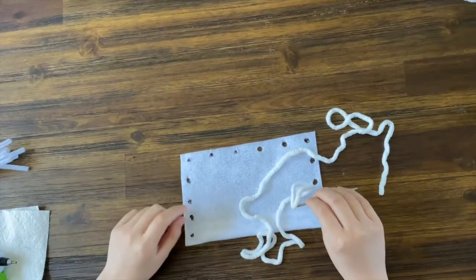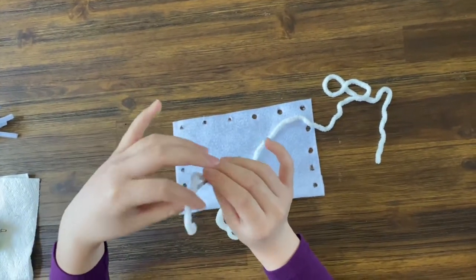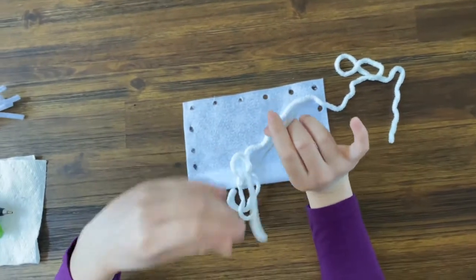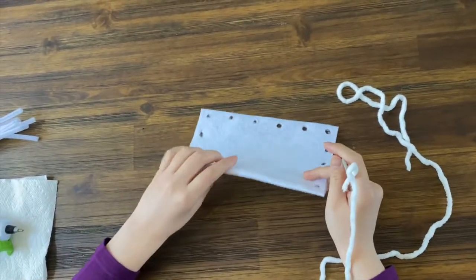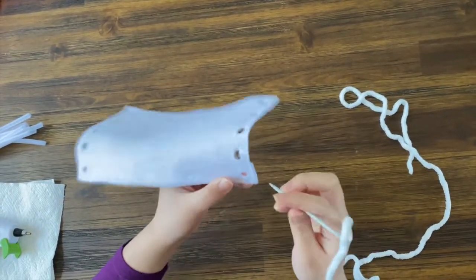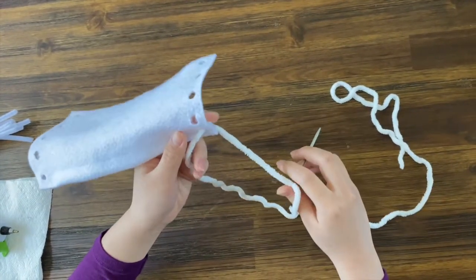The next thing you're going to do is take your yarn, which is about 43 inches in length, and thread it through a yarn needle. You don't necessarily need to, you can always do this by hand, it's just easier. And then what you're going to do is the end where the pipe cleaner is, you're going to take it through, leave about 6 inches out.